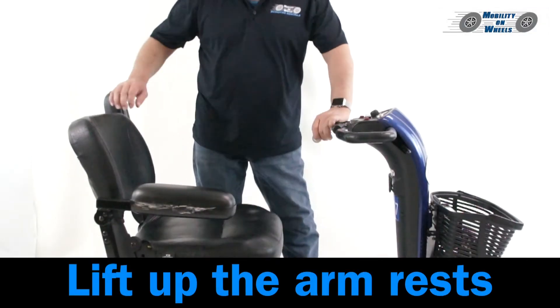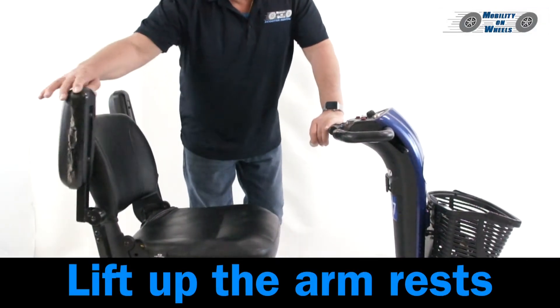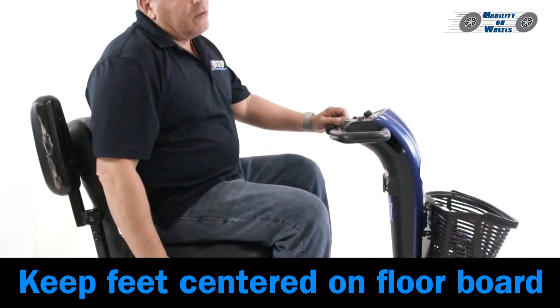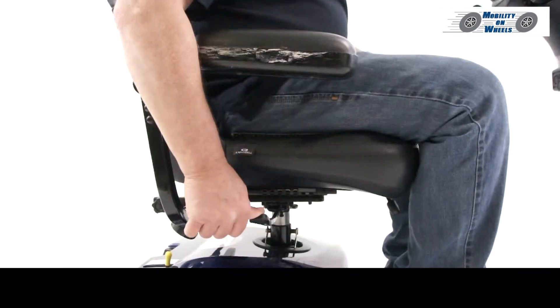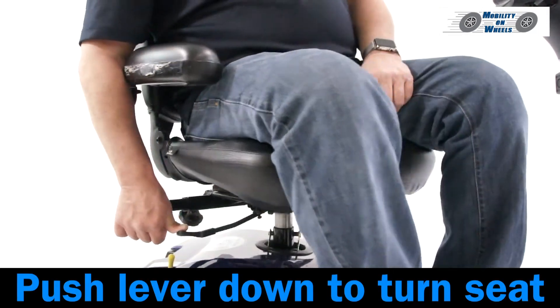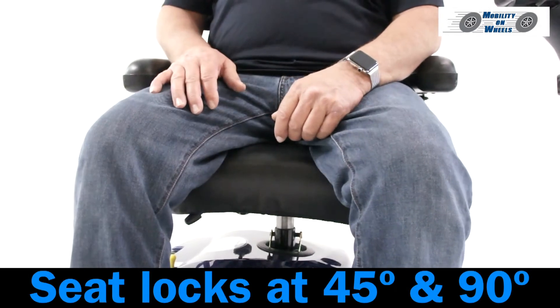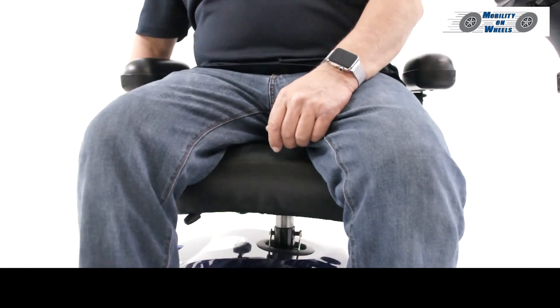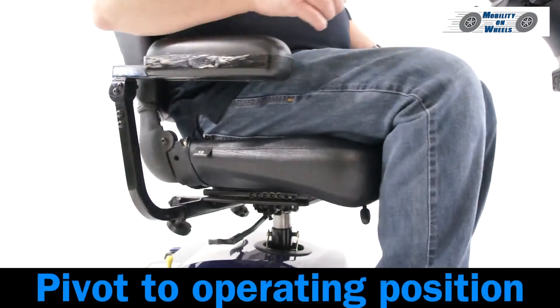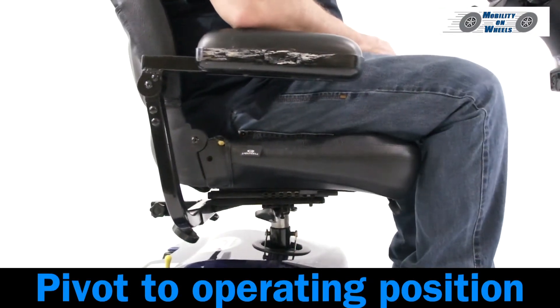Lift up the armrests. Keep your feet centered on the floorboard. Push lever down to turn the seat. The seat locks at 45 and 90 degrees. Push the lever down and pivot the seat to the operating position.